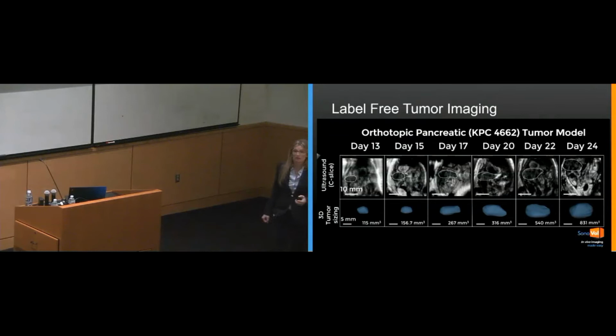We have various models. I do think here it's actually advantageous to have co-registration with bioluminescence, because these early time points are sometimes hard to discriminate anatomically. And so since you're scanning the whole mouse, or at least the area of interest, you can scan, scan, scan. If you're not sure whether you're seeing it, you still have captured the images, and it may be very prominent at a later stage, and then you can go back and capture the earlier phases. So that's one way of doing it, or co-registering with bioluminescence.